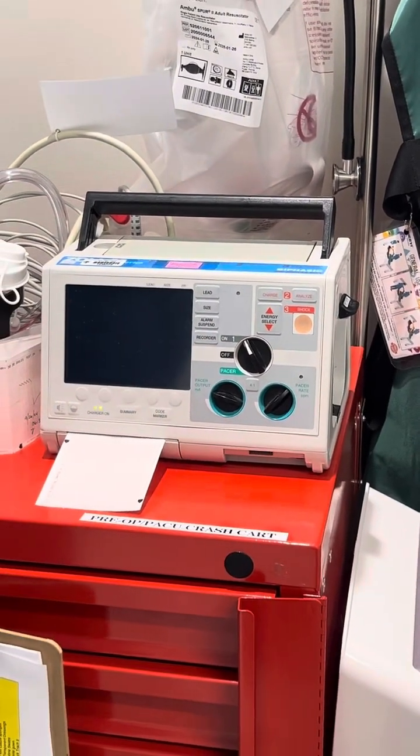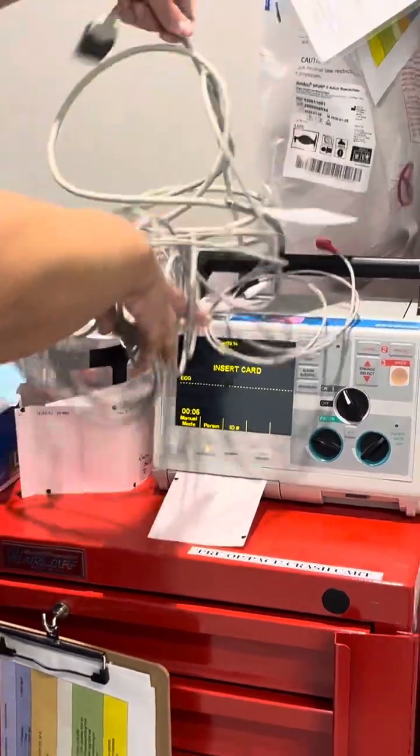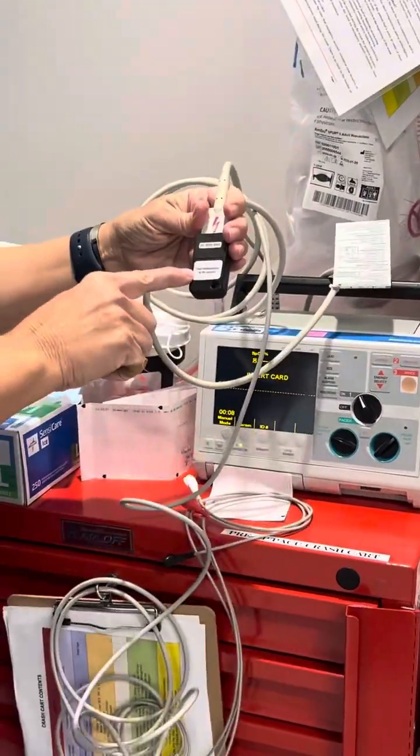You're going to allow it to charge. Check the pads. Make sure you're plugged into your test defibrillator.